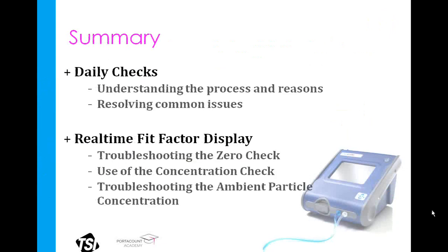So to sum up, we discussed the daily checks, understanding why we perform them and how we resolve many of the common issues. We also discussed the real-time fit factor display and specifically how we use this to troubleshoot not only the zero check, but also our ambient particle check.